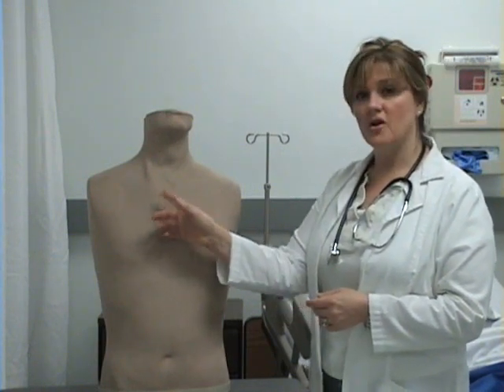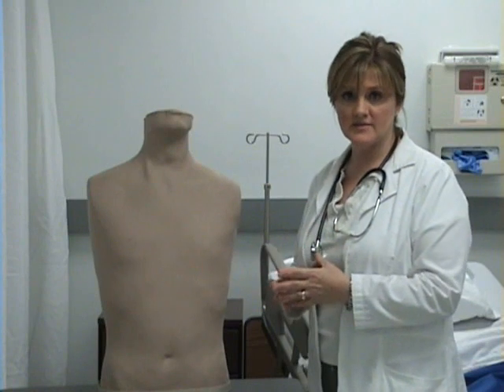Now we're moving on to the cardiac system. The cardiac system has 3 components. The first is going to be auscultating the heart valves. The second is going to be checking capillary refill, and the third is going to be assessing pulse points. Let's begin with the heart valves.